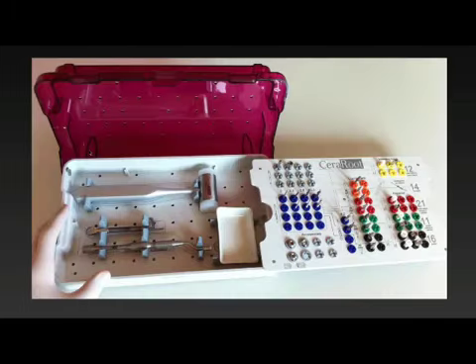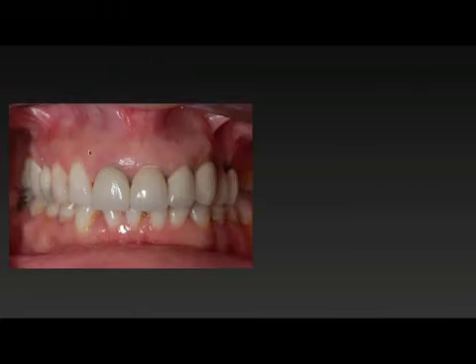The surgical kit is very basic. I'm not going to go into too much detail about that, only to say that the tooling with this system exists in either steel or ceramic drills and tools. The advantage of ceramic drills, in my hands, is that drills are much sharper and they stay sharper for longer. Very nice to use these, and they stay cooler than the steel does, as ceramic is not a conductor of heat, it's an insulator, so you get a lot less heat from using these drills.